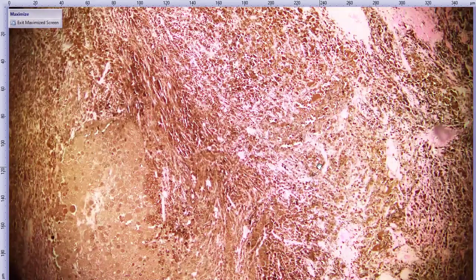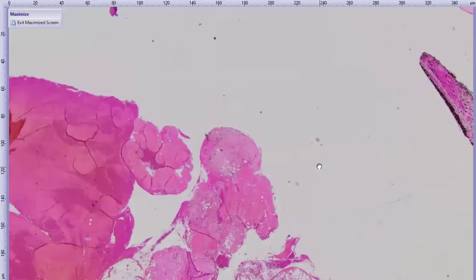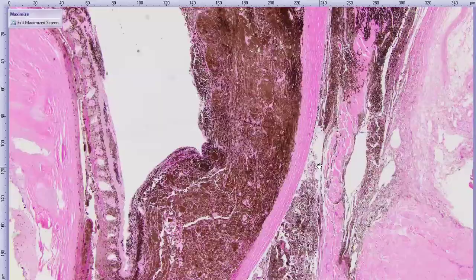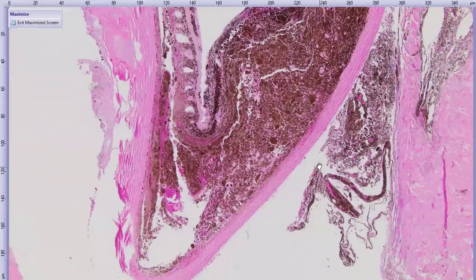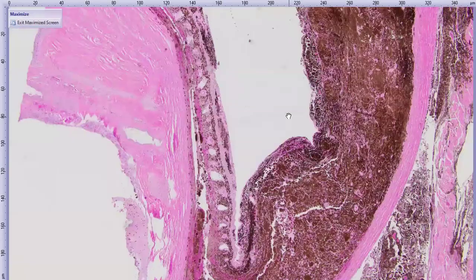It seems like, if you go to the lower mag again, the iris is not as affected. We've got great areas of the iris that are not affected. This is not a complete section. The more affected areas are the ciliary body, and then it extends right through the sclera into the episclera and into the choroid here. So this is choroid here.